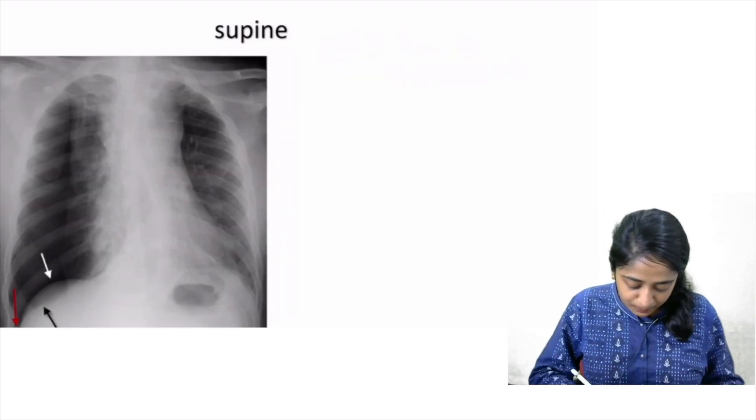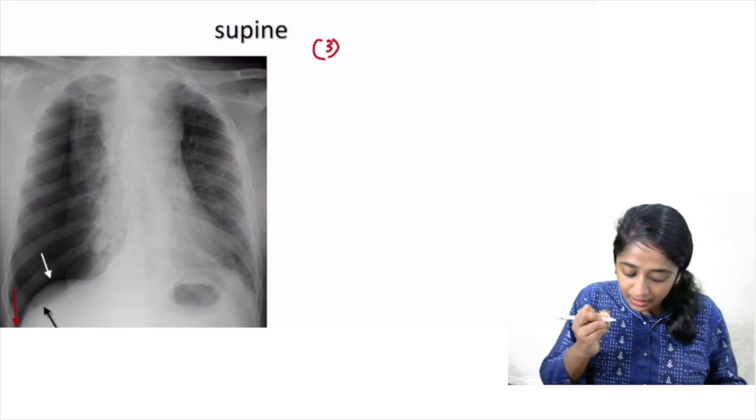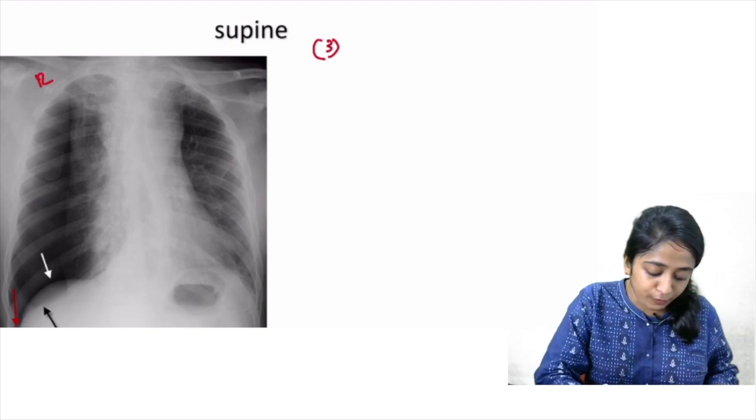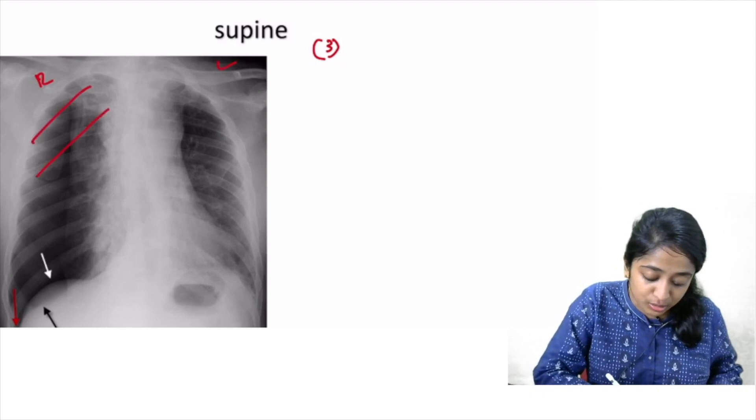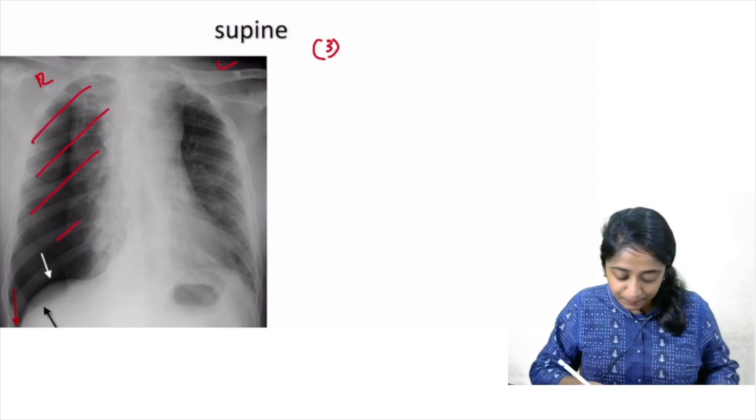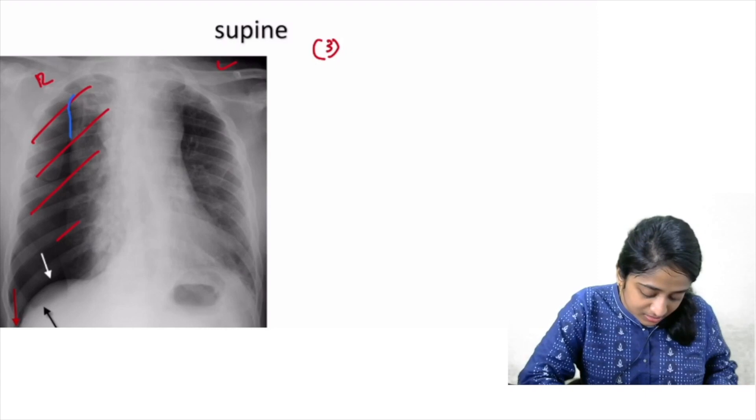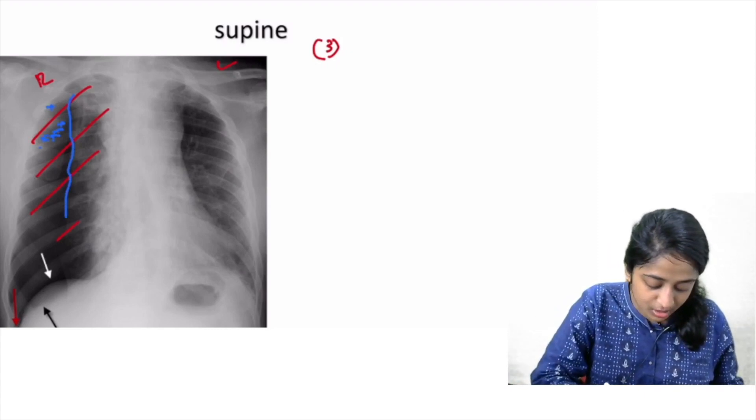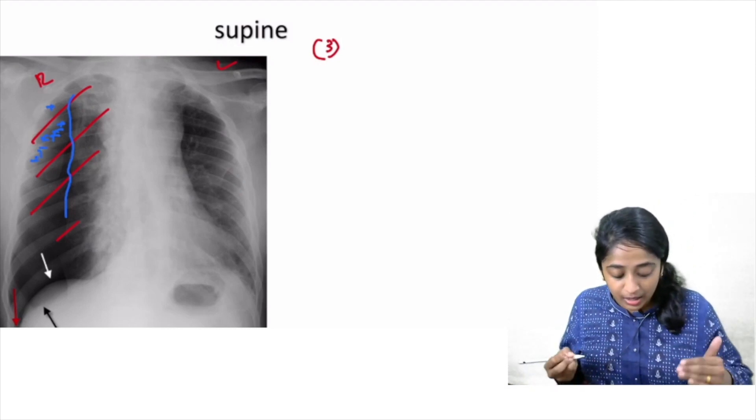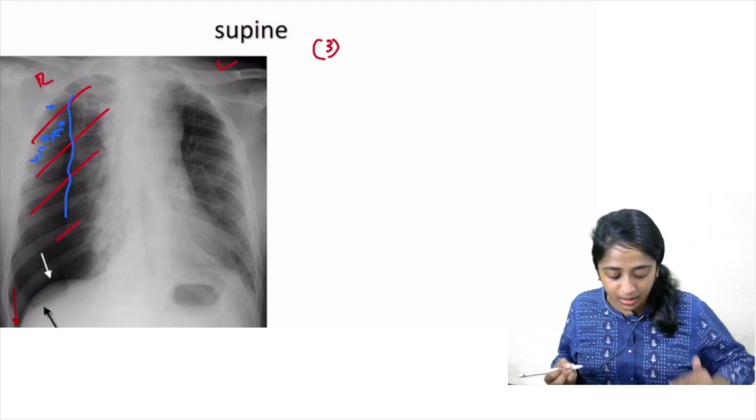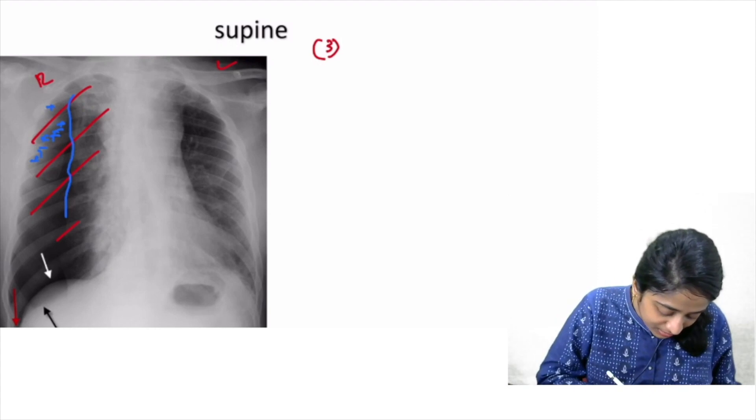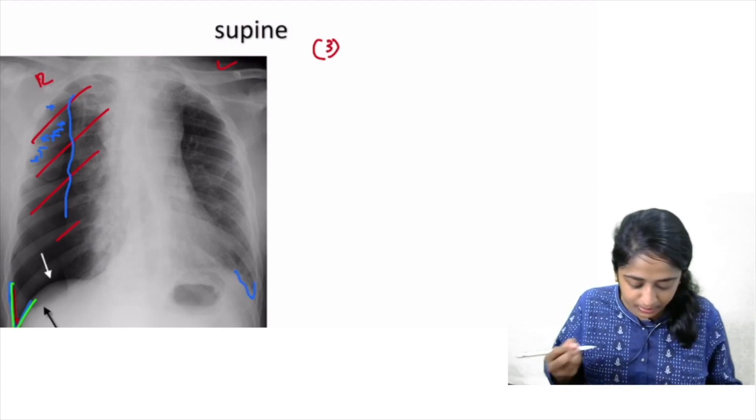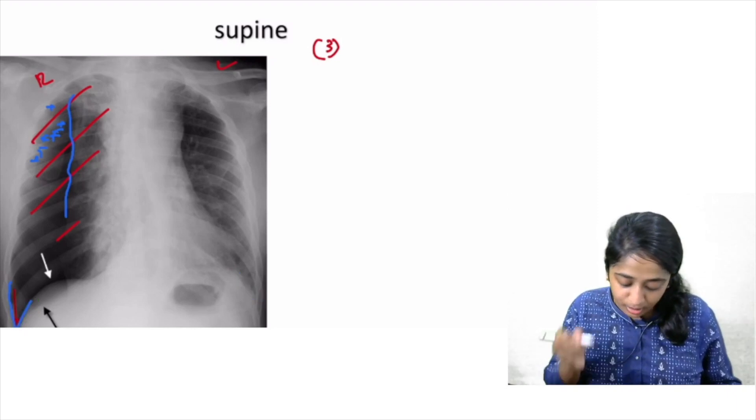Now let's come to the third important sign. So this is very apparent here. Comparing the right and the left lung field, there is increased lucency on the right side. More importantly, I can see the displaced visceral pleural line and distal to this, there are no lung markings, no vascular markings. Now what else is apparent when you go deeper down? You can appreciate the deep sulcus sign. Compare the deep sulcus sign you can appreciate.